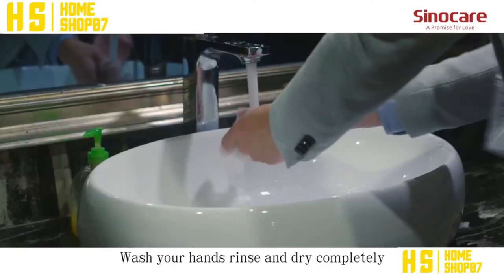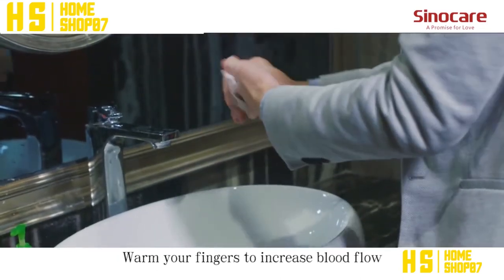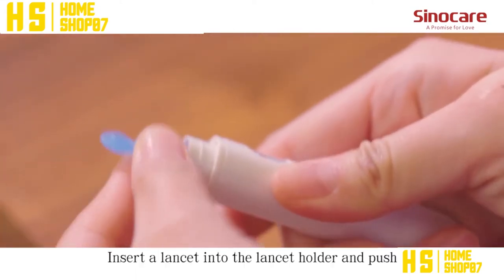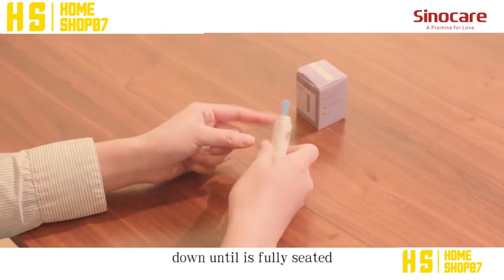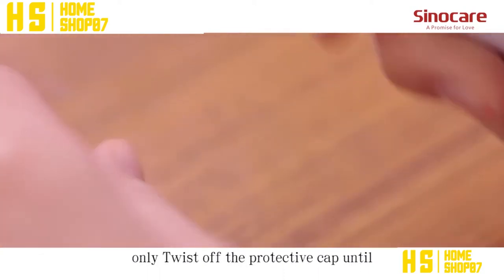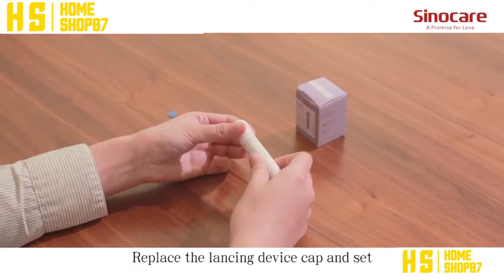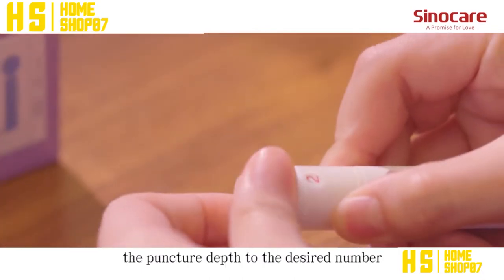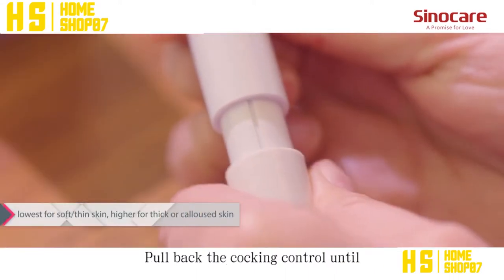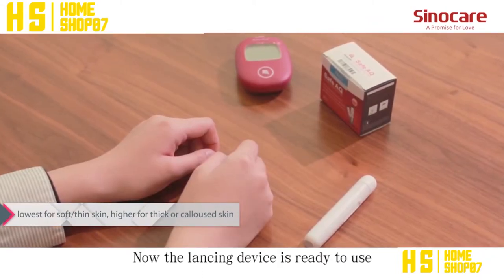Wash your hands, rinse and dry completely. Warm your fingers to increase blood flow. Screw off the cap of the lancing device. Insert a lancet into the lancet holder and push down until it's fully seated. Note that the lancet is for one-time use only; twist off the protective cap until it separates from the lancet. Replace the lancing device cap and set the puncture depth to the desired number. Pull back the cocking control until it makes a click, then release. Now the lancing device is ready to use.